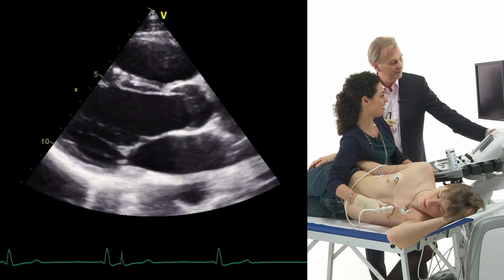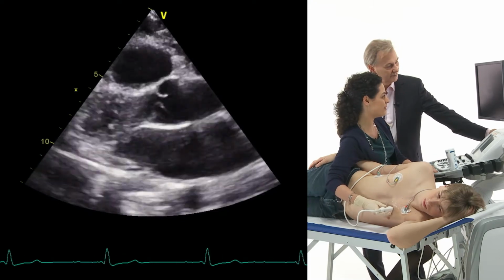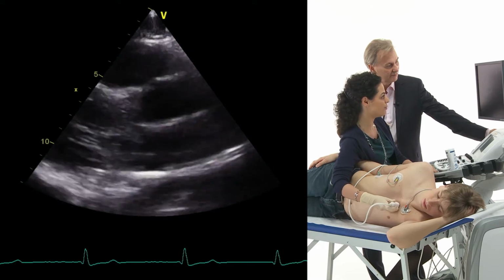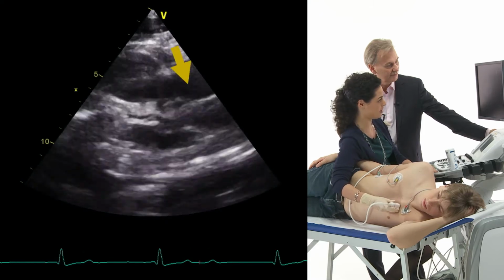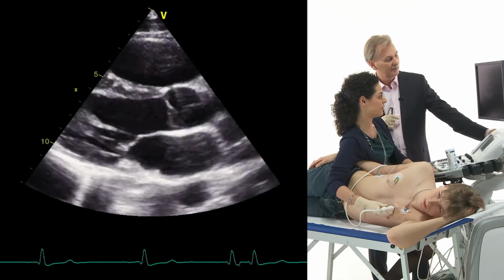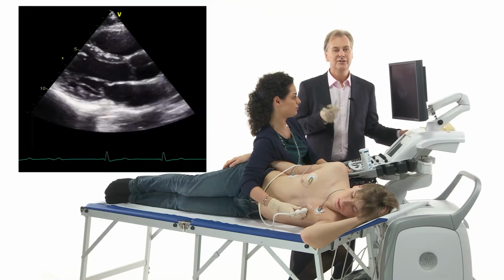Yes, exactly. This is a perfect view to visualize the aortic valve and root together with the ascending aorta. And this is extremely important to have a full picture of the two. It's an important structure because there you will see a number of different pathologies, and you will also learn that the aortic valve is very closely connected to the ascending aorta. That wasn't hard. But to make you really better understand, I would like now to go back to our simulator.